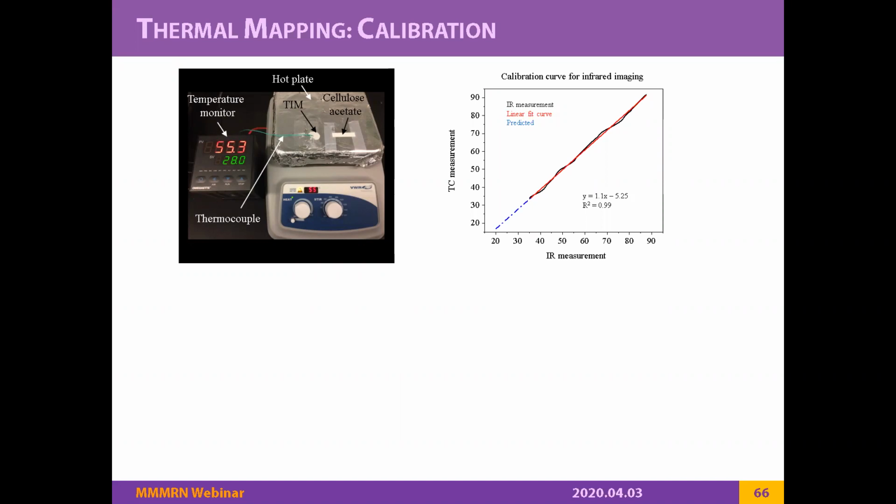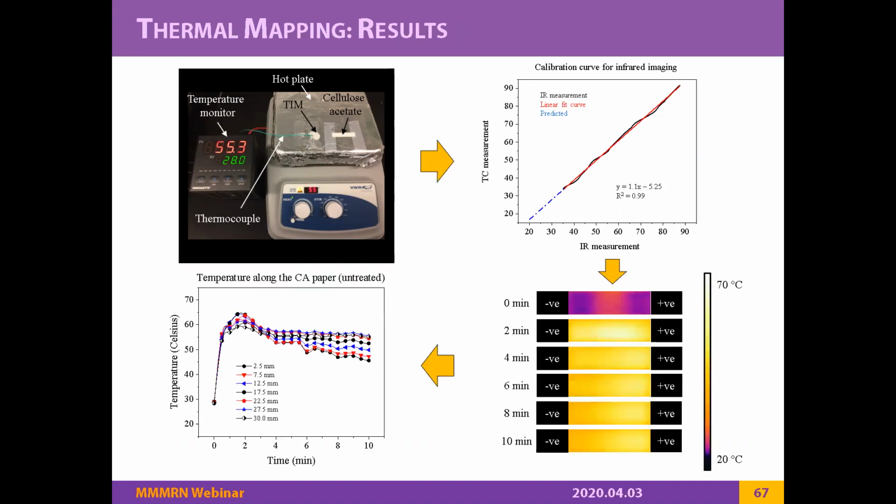All I can say is that the temperature profile you see will remain the same even if it impacts the result. So even if you don't want to take the absolute value of the temperature plot with absolute certainty, you can actually look at the trend, how it goes, right? That itself gives you a lot of insight into how the system is working. Does it make sense?